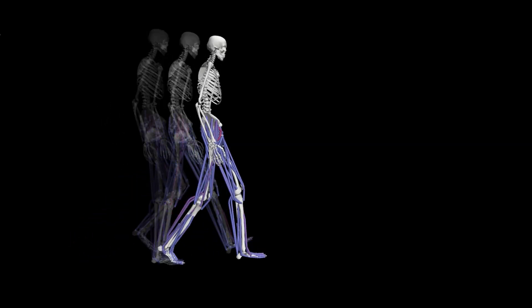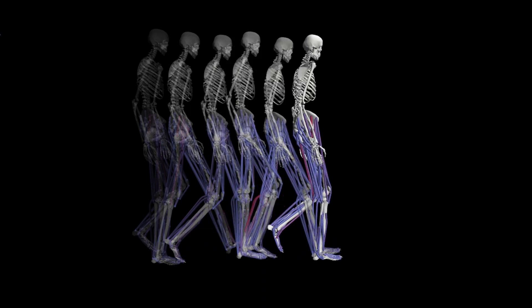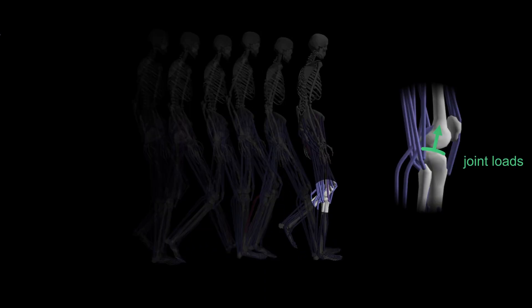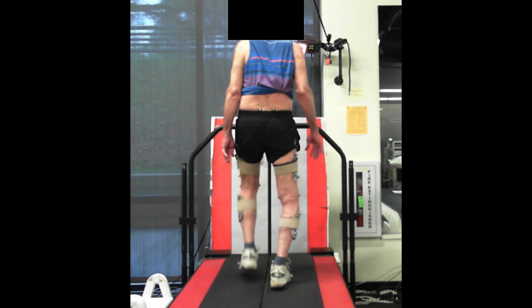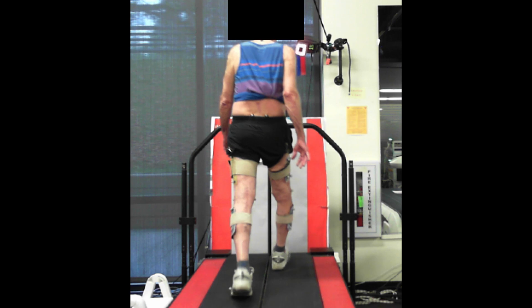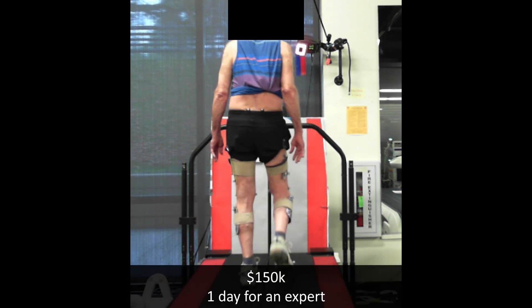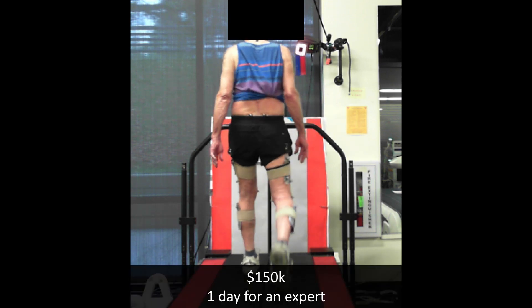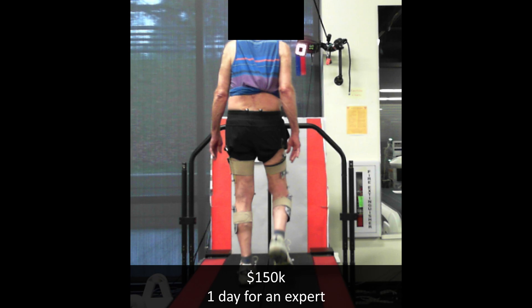Measures of human motion and the musculoskeletal forces that underlie it, like the loading in an osteoarthritic joint, relate to injuries and disease progression. These quantities are rarely measured in the clinic because they require an expensive motion capture laboratory and time-intensive analysis by an expert.